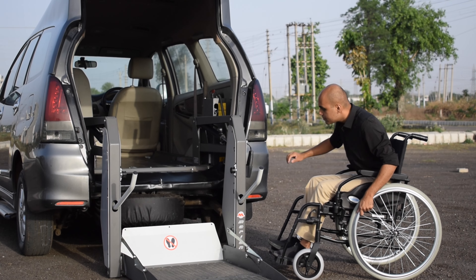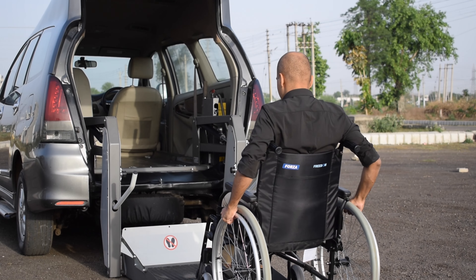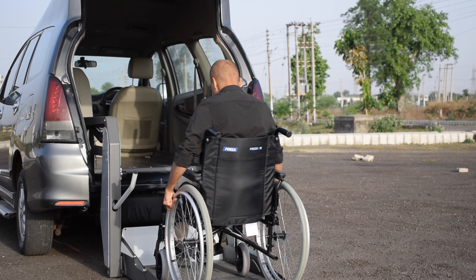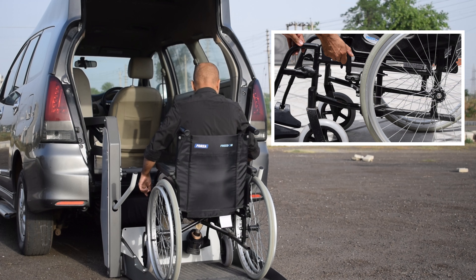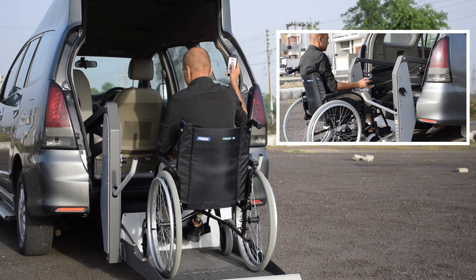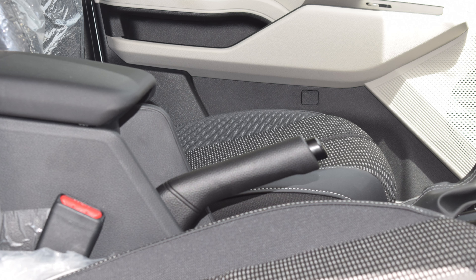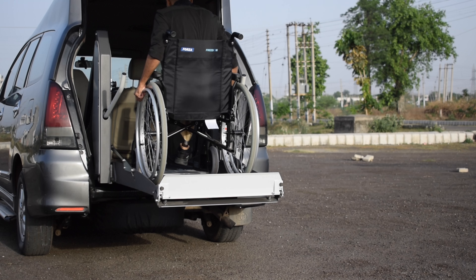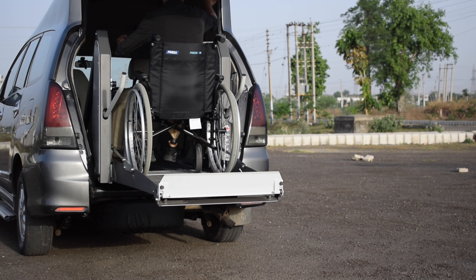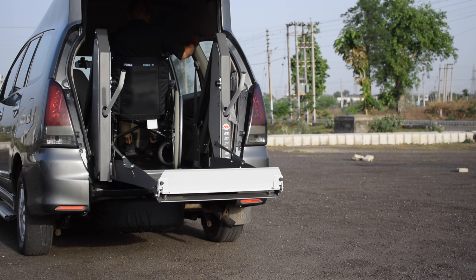There are a few points that are advisable before using these lifts. Never use the lift with the vehicle engine on. The wheelchair brake must be on before starting any lifting or lowering operations on the platform lift. Park the vehicle out of the traffic flow on a flat horizontal area and make sure the working area of the platform is wide enough and free from obstacles. Always engage the emergency vehicle brake for safety reasons before starting the lift. The operator must make sure there are no persons, animals or things that interfere between the platform and the vehicle before starting any operation.